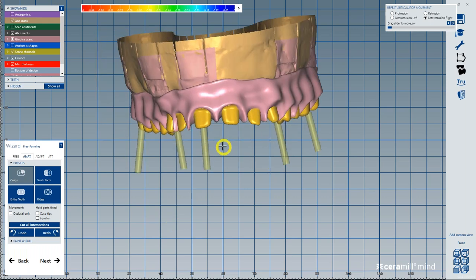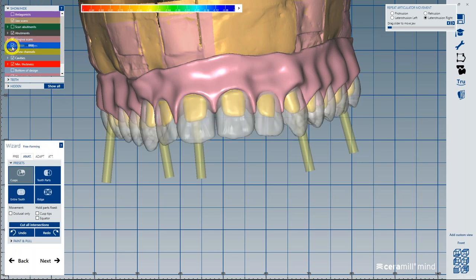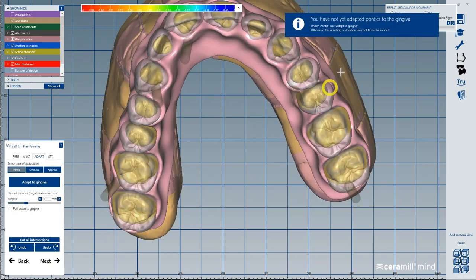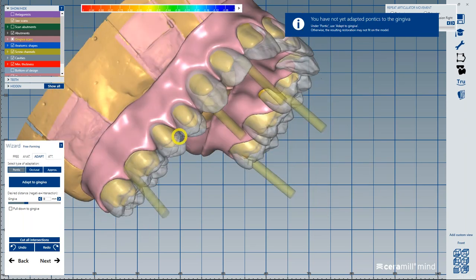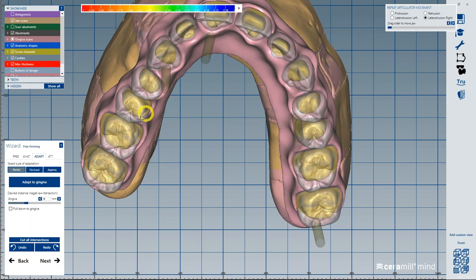So freeforming, you have to resist the temptation to start adjusting this, because if we look at our anatomical shapes, it looks like this is way too short and you want to move this. That's not the time. You don't have to worry about that. Our software will do it for us. So we're going to hit next. This stage, adapting pontics, we don't have to adapt pontics to the gingiva. The gingiva is already one solid piece, so it has no relationship with the pontics, so we can go next.